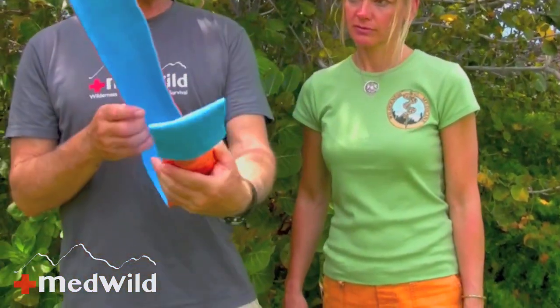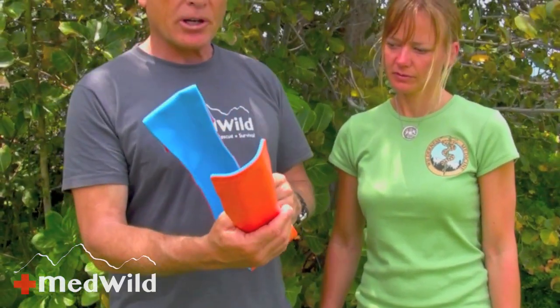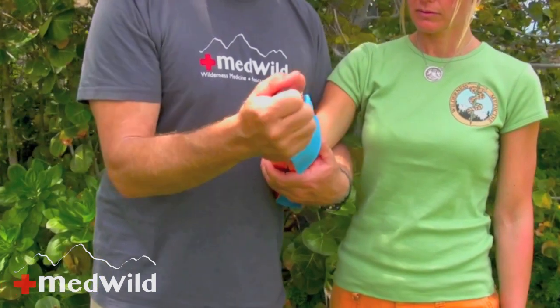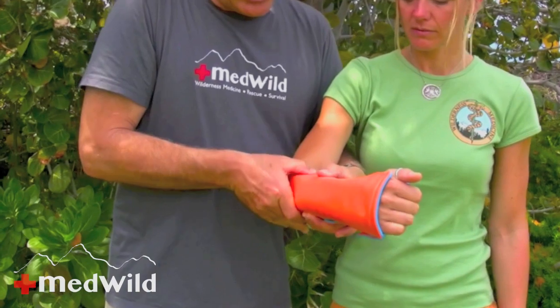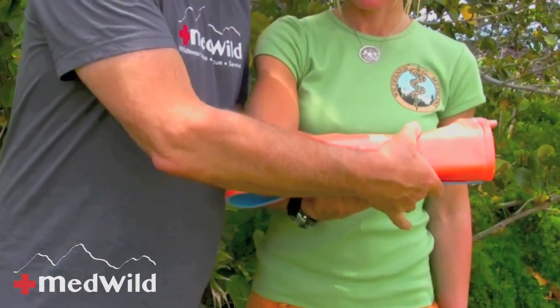Now I have the SAM splint formed into fairly rough structural bends, approximately fitted to her forearm. Next I'm going to fine-tune this and place it on Denise's arm. You'll notice she's still able to bend her fingers, which is good for maintaining range of motion, especially if the splint is on for many days. I'm just going to start molding it gently, trying to avoid a lot of manipulation especially over the break.